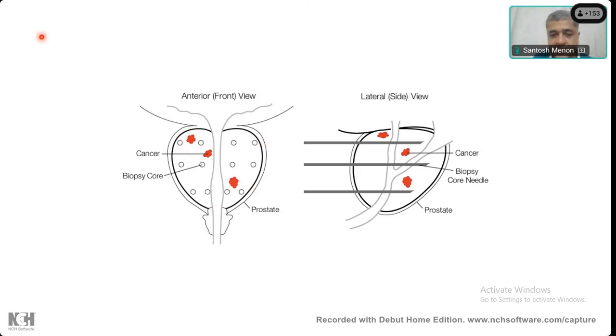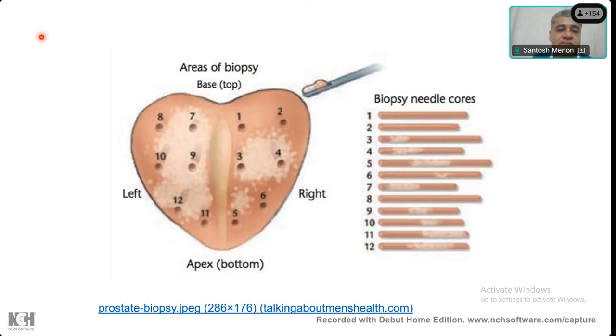It's a multifocal cancer. We are trying to sample something and we may or may not hit it with the needle biopsies. Again, a picture to show that all 12 cores are done here. All these gray areas are the tumor and the brown is the benign prostate. If you look at these core needles, some of them do not have cancer. Some of them will hit the cancer. You understand? That's very, very important for us to understand what we are going to talk about later.